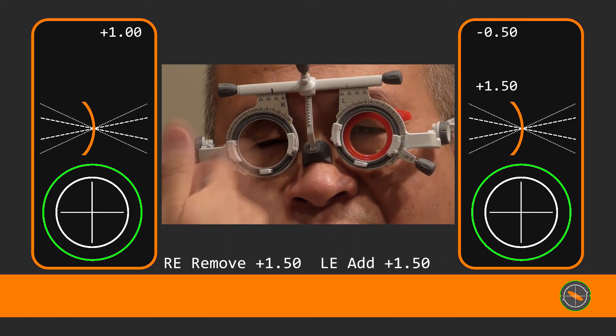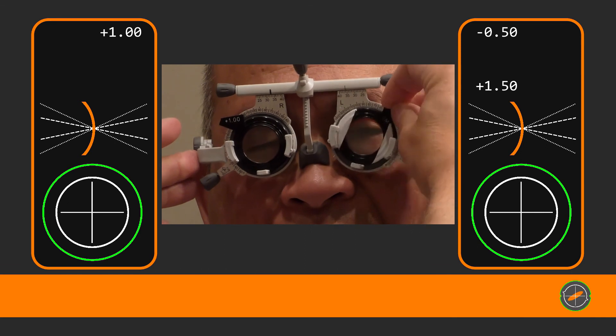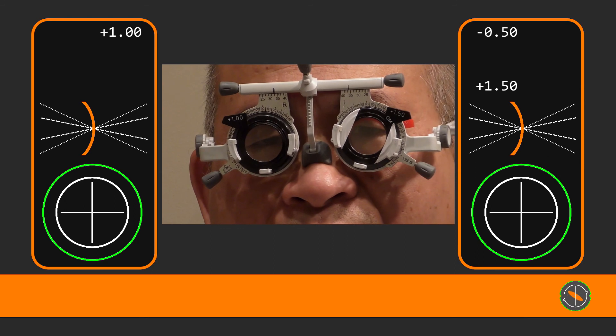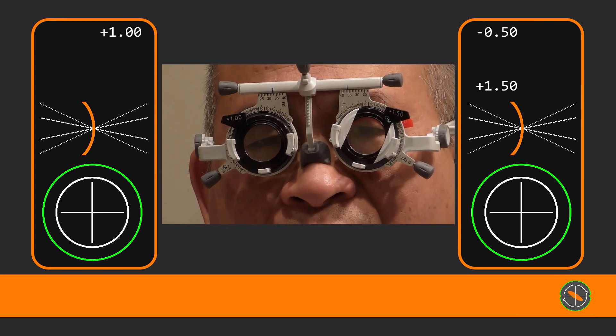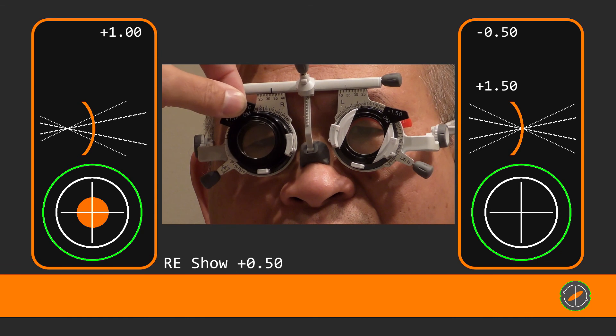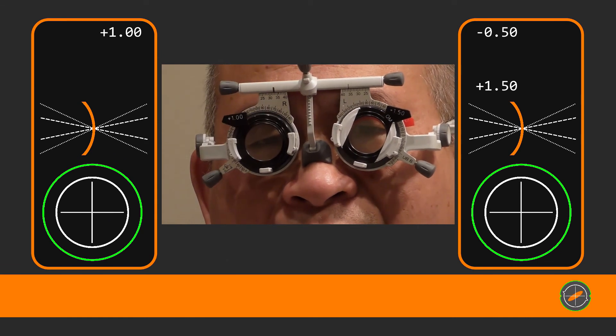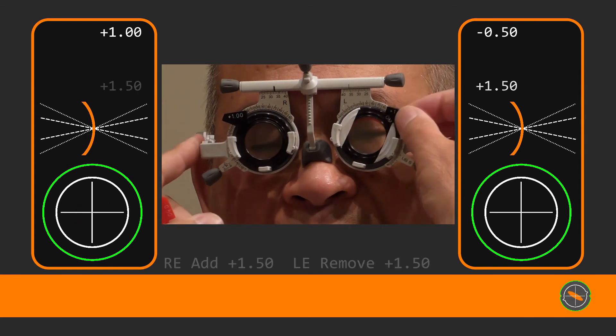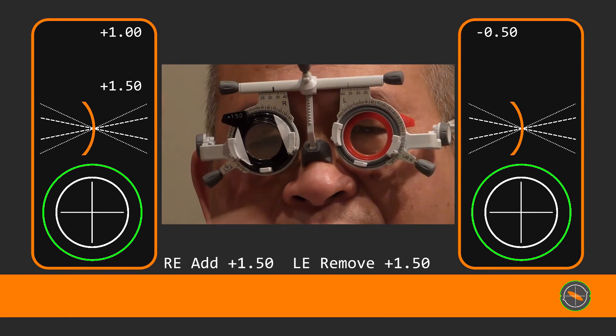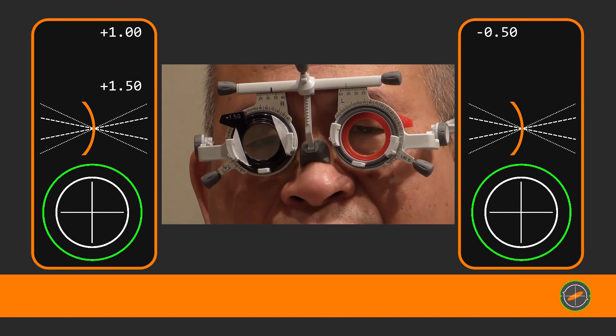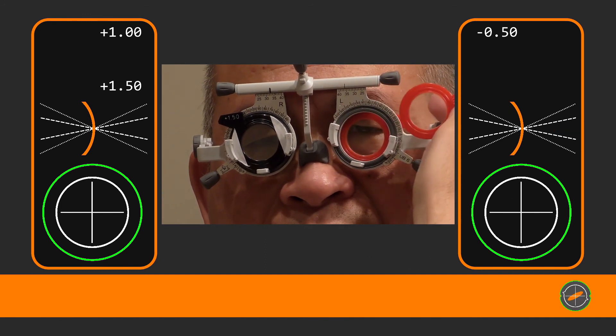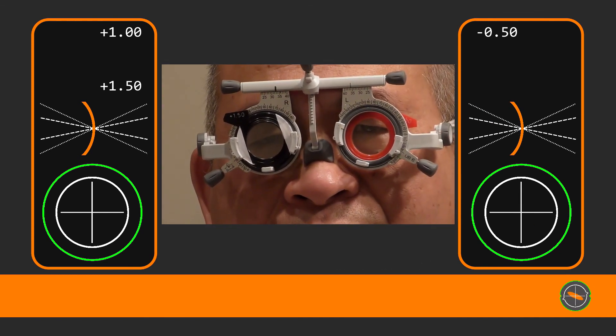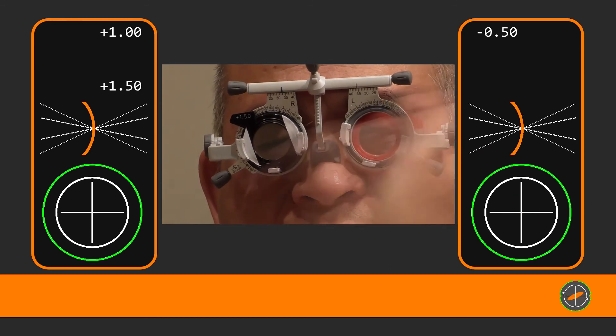So we'll just swap back over. There's that error again now. And that's blurry there isn't it? Should have shuffled. Keep looking up there now. Better with this one or without? Without. And better with that one. Without. I keep doing this for quite some time sometimes to relax the accommodation. Better with that one. Without. Great.